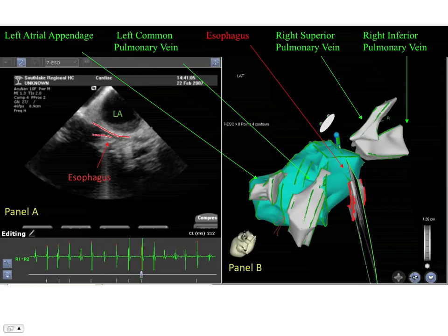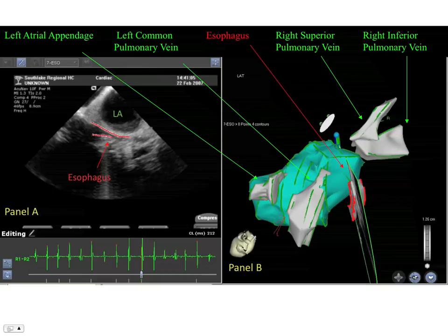This panel shows that we can not only image cardiac structures, but also very important extracardiac structures such as the esophagus. The red lines in the panel on the left outline the esophagus as it courses behind the left atrium. The panel on the right shows the esophagus in 3D space behind the posterior wall of the left atrium. In green, one can see the shell of the left atrium, and in gray, the bodies of the left atrial appendage, left common pulmonary vein, right superior, and right inferior pulmonary veins.